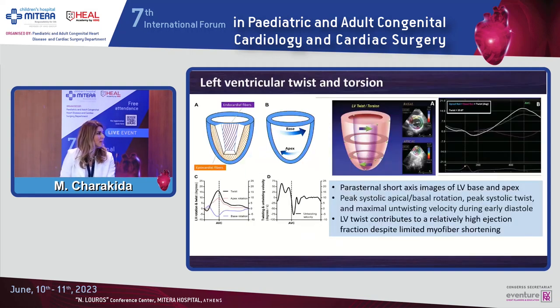Additionally, we can have more information about left ventricular function by assessing the twisting and torsion. These give us the same information: the basal to apical gradient in the rotational angle of the heart along the longitudinal axis. We know that if we see the heart from the apex, the basal segments turn clockwise and the apex anti-clockwise.